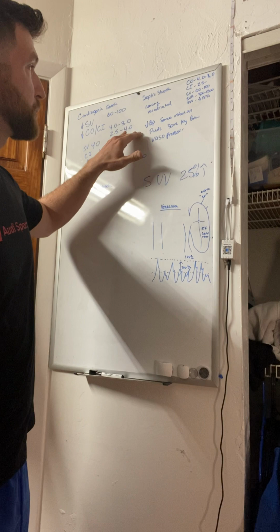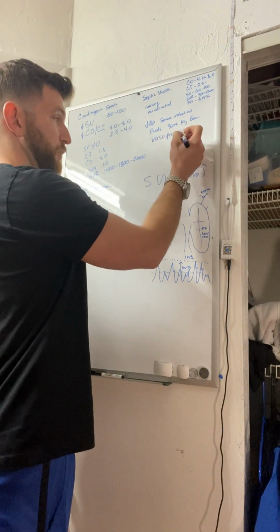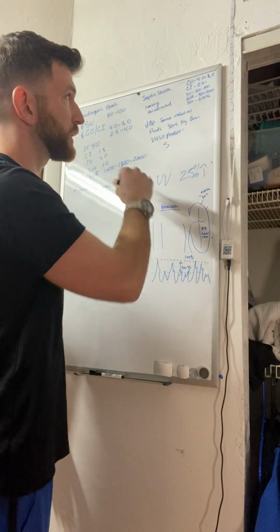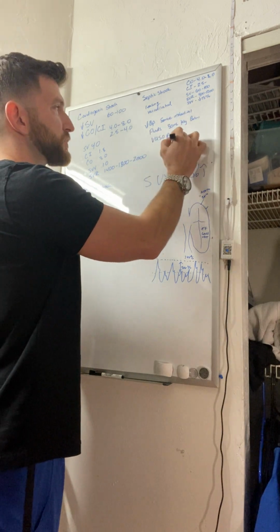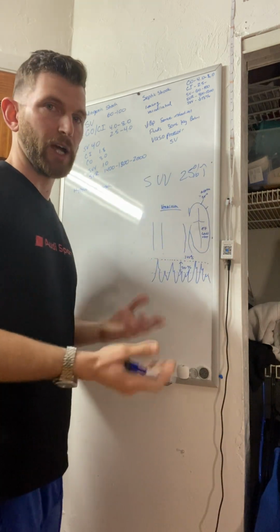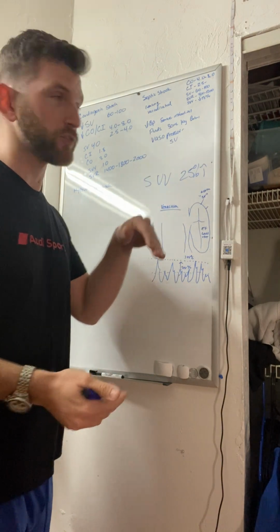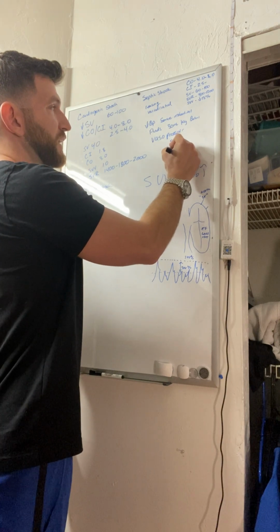All right, so that is septic shock. What does that look like? Septic shock can look like a few things, but typically what you'll judge for septic shock is a normal cardiac function, normal cardiac index, normal cardiac output. Maybe their stroke volume's a little on the lower side. It could be, or it could be completely normal, because remember, if they're dehydrated or they have low fluid in their vascular system, then the stroke volume could be a little on the lower side until you start giving them those fluids. But the bigger thing you're going to see is the SVR.